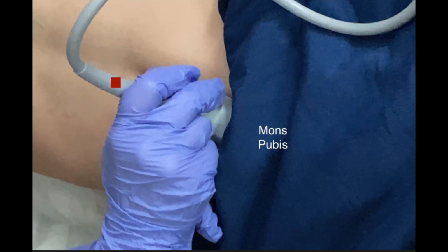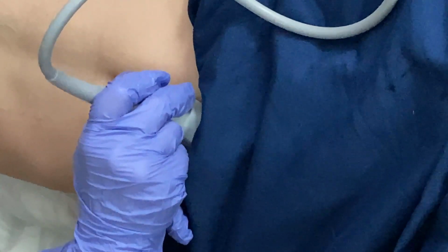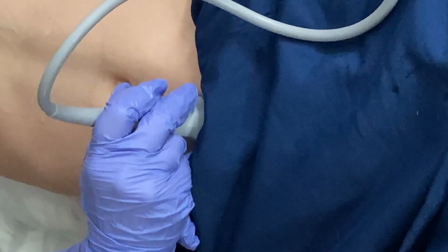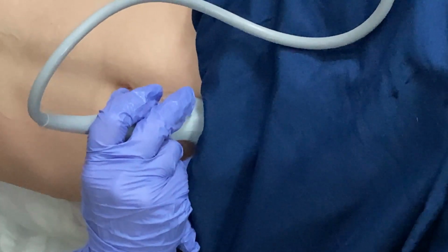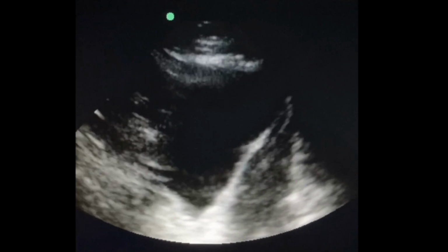To evaluate the pelvis for the FAST exam, place the probe in long axis at a 45-degree angle pointed toward the patient's feet, just superior to the mons pubis. The indicator should be facing the patient's head. Then fan laterally from each lateral wall to evaluate for any fluid accumulations between the patient's bladder and their reproductive organs.